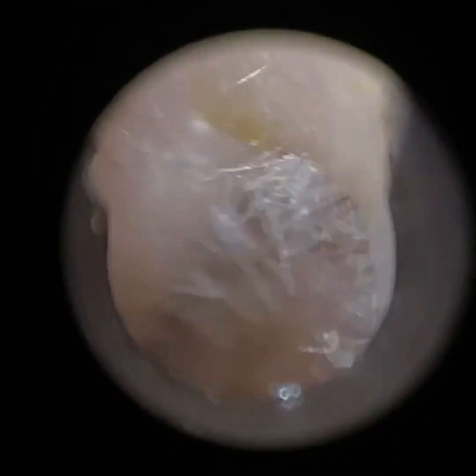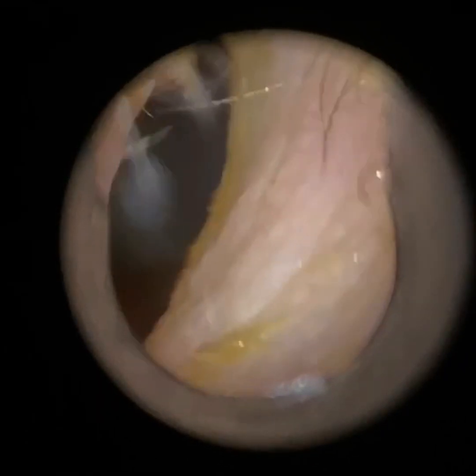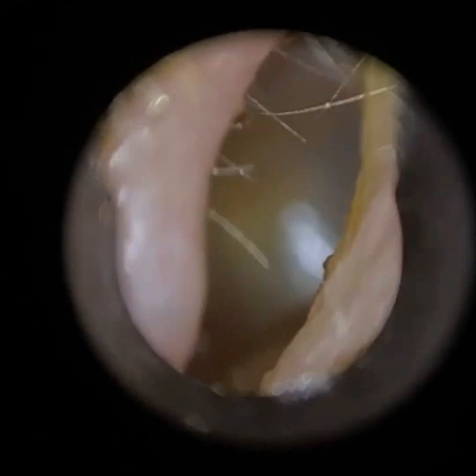You can see he's got this out. I did give him some feedback, because I think he could have dilated this ear a bit more than he actually did — and you'll see in a moment he actually dilated it even further, which is no mean feat in itself, to visualise the eardrum which wasn't even fully visible given how narrow the patient's ear canal was. Just be a bit more confident and stretch the ear a bit more during the procedure. This is testament to Maxwell's skill, dedication, and willingness to learn — and also why I've developed the Waxscope.